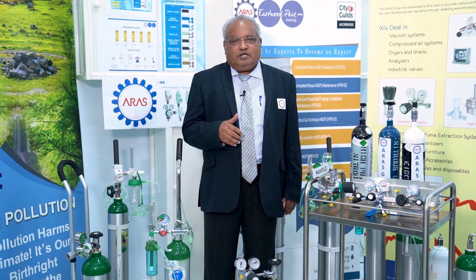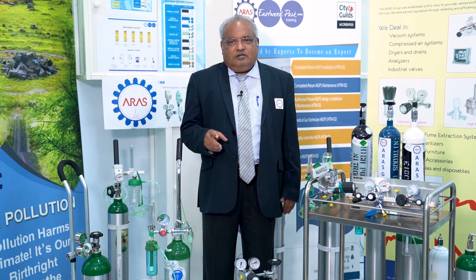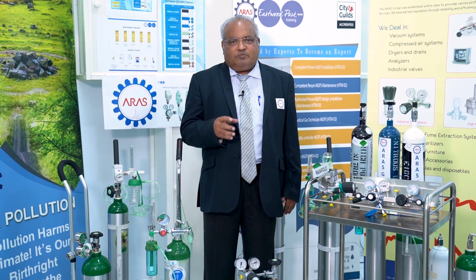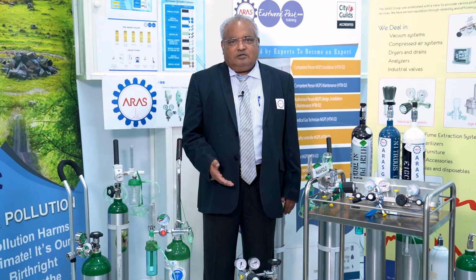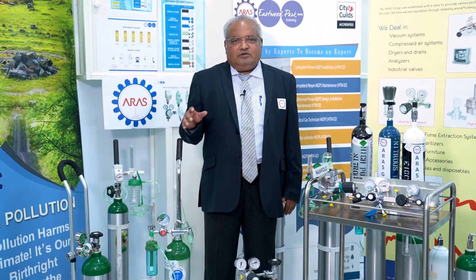Mainly, we have to use calibration, that's very important. The connection is also very important. Either it should be a pin index regulator, or if you are providing a bull nose, make sure its connection is for oxygen only. Before connecting the patient, make sure what gas you are supplying. That's very important, because when you look at the color code, you will find out what the cylinder is used for. Okay, thank you very much for the time.